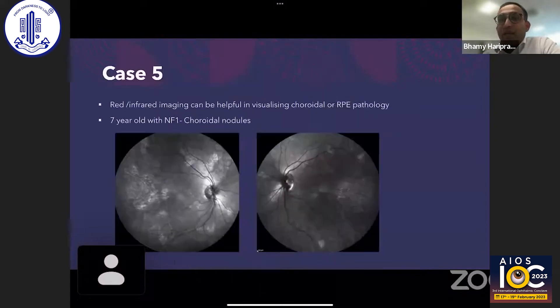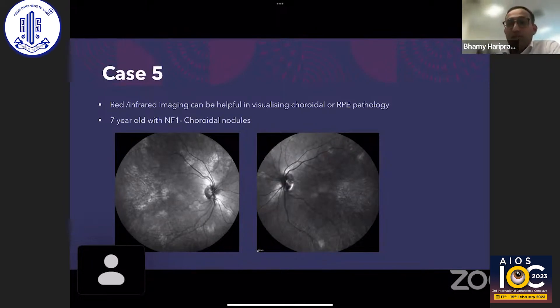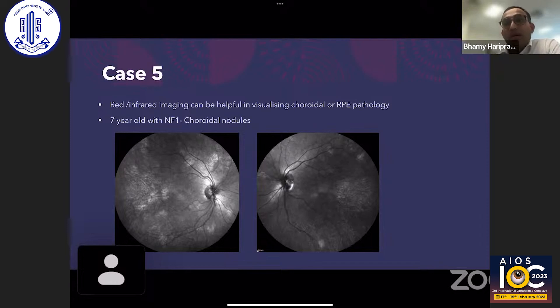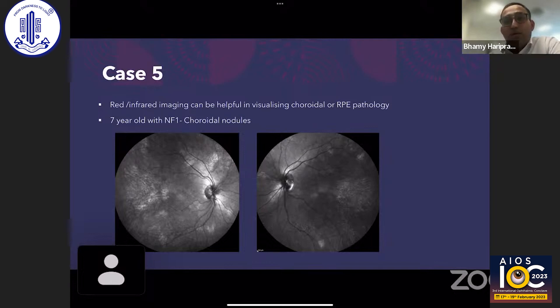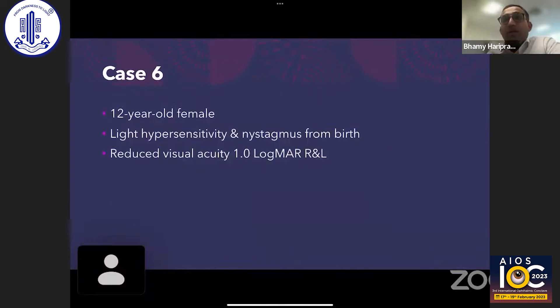Case 5 is a seven-year-old with NF1. These individuals can get iris Lisch nodules, but they can also develop choroidal nodules that are not always easy to see and may not be accompanied by Lisch nodules. Near-infrared reflectance imaging shows these choroidal nodules very clearly. This child had no Lisch nodules but showed choroidal nodules on infrared imaging. Patients with choroidal nodules may be more prone to developing optic pathway glioma and should be imaged with MRI.